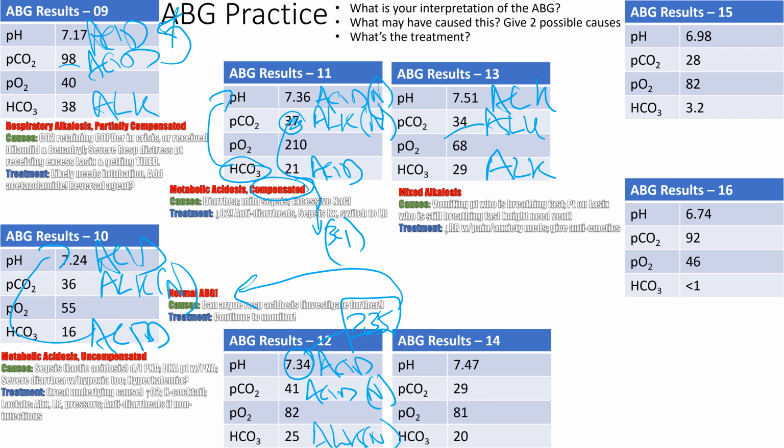We got ABG results of 7.47. What's that? So this is alkalotic. And then what caused it? Is this alkalotic, bicarb 20? No, 20 is acidosis. So there's another trick. This is actually a real ABG you should interpret. So that's acidosis. That means the other one's alkalosis. And that sure is, that checks out, right? Less CO2, less acid means alkalosis. So they're doing what? Breathing fast or slow? They're breathing fast, right? Breathing fast, so why are they breathing fast?